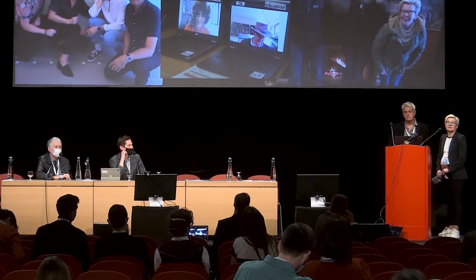Yes. So the scope is in the nose. It's not lower than above the tongue, base of the tongue. So I believe that when we use MIE device, we often instruct the patients to keep their mouth open. So most of the flow is going through the mouth, not through the nose.